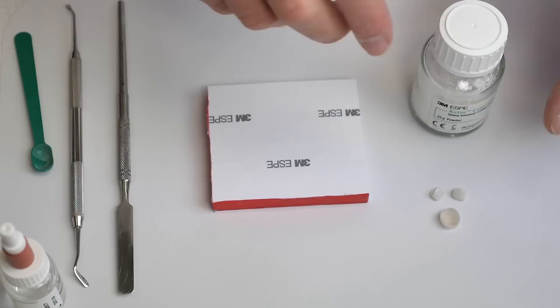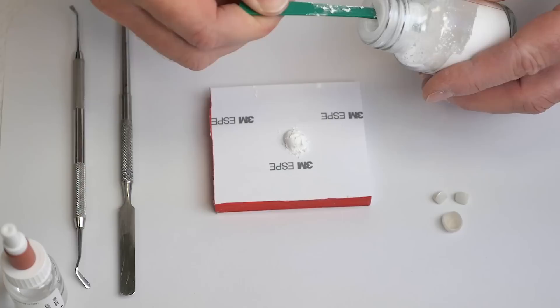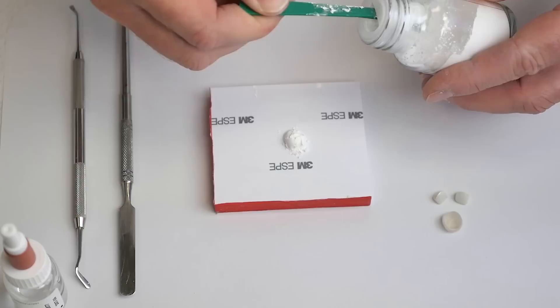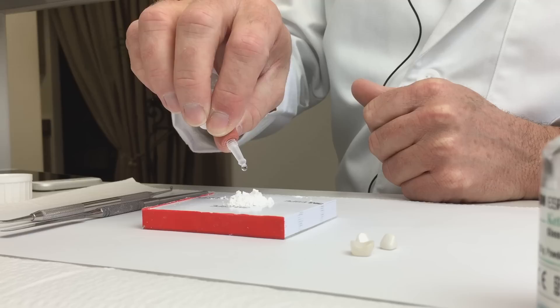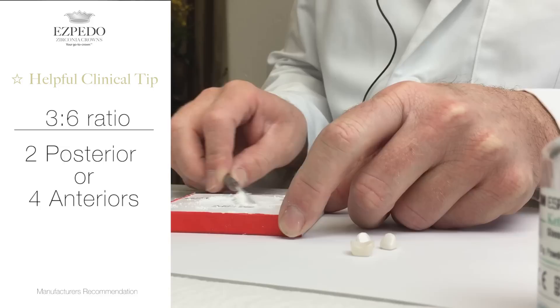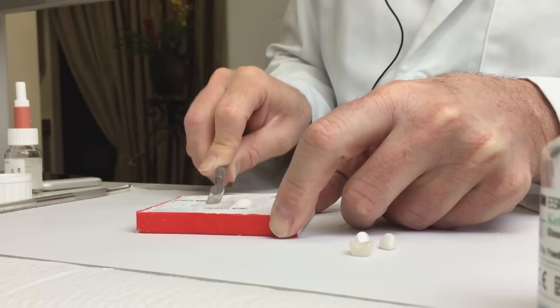A couple of points: I don't mix my own cement — my assistant is much better at it than I am. We're going to be mixing two scoops of powder with four drops of liquid; that is the recommendation from the manufacturer. I like it a little thicker than what the manufacturer recommends, but get comfortable first with their recommendations, then fine-tune it once you get proficient. Two scoops will give you enough cement to fill one posterior crown or two anterior crowns. If you're seating two posteriors or four anteriors, use three scoops of powder. Incorporate all the powder into the liquid, then spread the mix across the pad with your spatula until it's completely mixed.